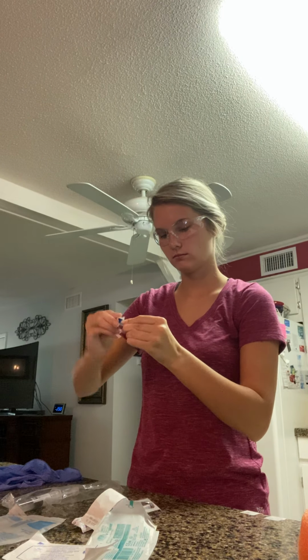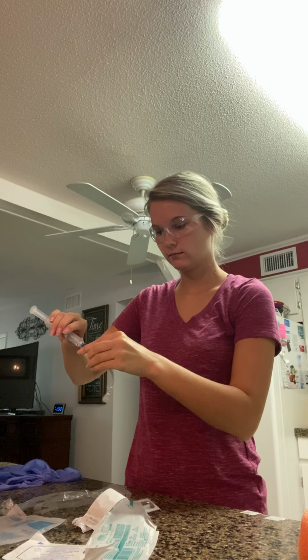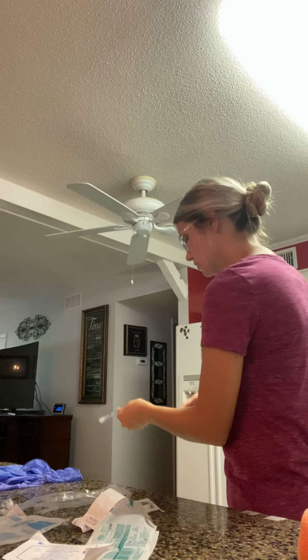I would then swab the injection cap. And I will loosen the cap of the extension, and I will connect the saline. And prime the tubing.